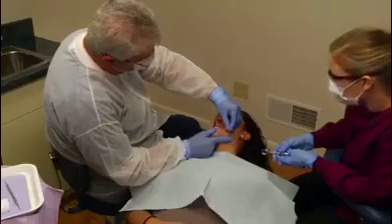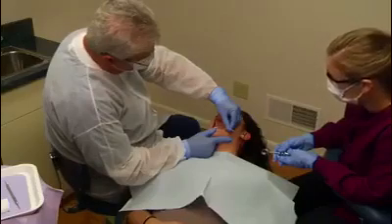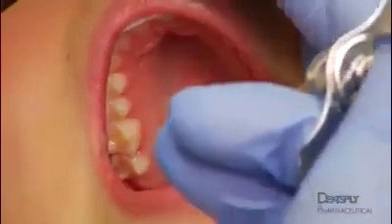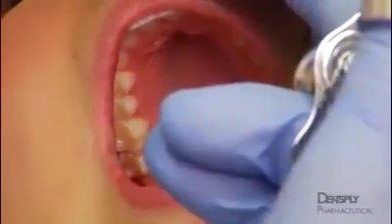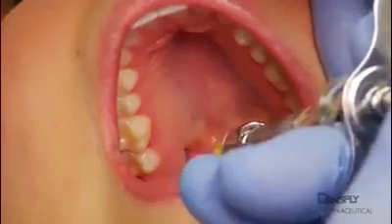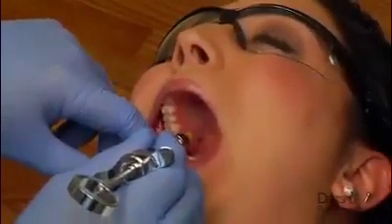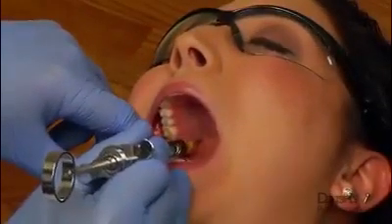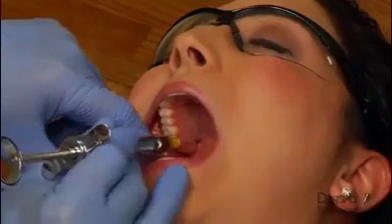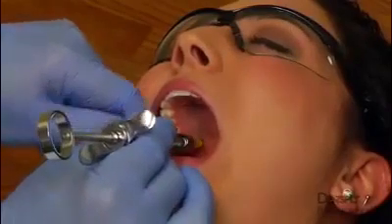Topical anesthesia of the hard palate is not easily achieved with conventional preparations. Additional anesthesia may be obtained by applying pressure to the injection site with a cotton-tipped applicator. After about 20 seconds, the needle is inserted into the foramen as pressure is maintained, and 0.1 to 0.2 milliliters of anesthetic solution is slowly deposited. After waiting 2 or 3 minutes, the needle is advanced slowly through the greater palatine foramen and up the pterygopalatine canal. A pen grasp of the syringe facilitates the gentle probing that may be necessary to navigate the canal.